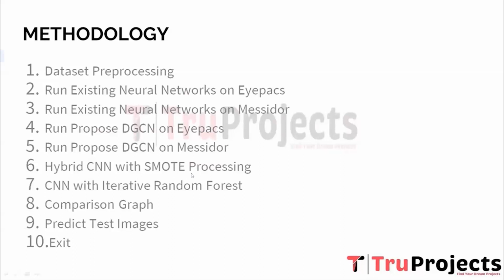Sixth, hybrid CNN with SMOTE processing. This step likely involves using a convolutional neural network in combination with the synthetic minority oversampling technique, that is SMOTE, to address class imbalance in the data. It generates synthetic samples for the minority class to balance the dataset.